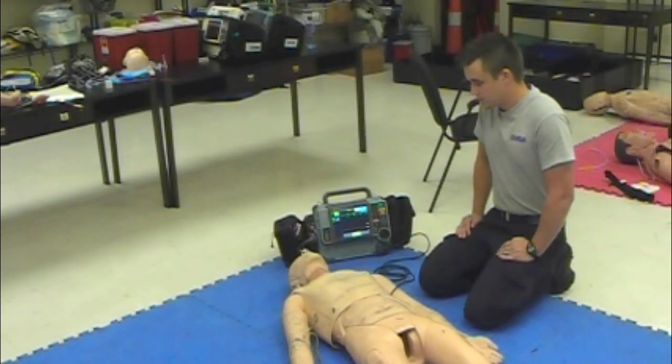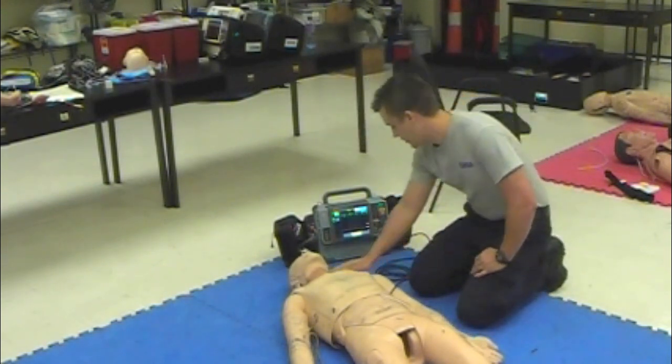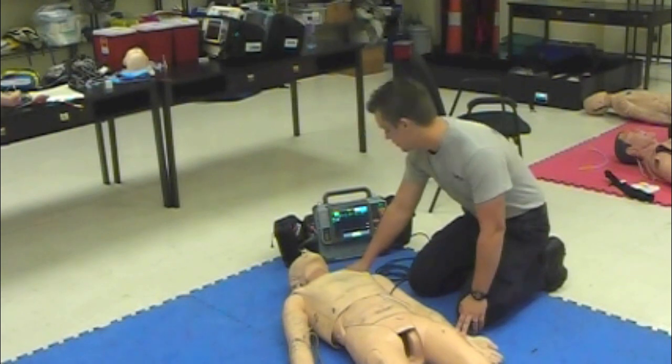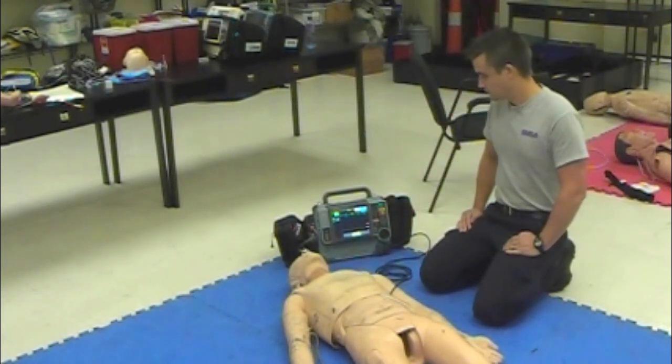And it's been 2 minutes. Okay. So I'm going to do a pulse check. Do I have a pulse with this? No pulse. All right. So continue CPR, continue ventilations for another 2 minutes. All right. It's been 2 minutes.